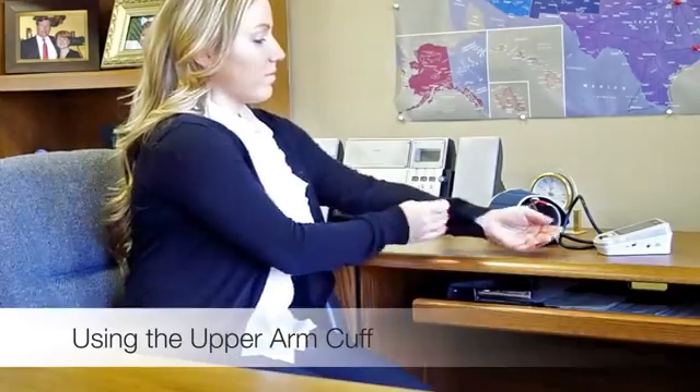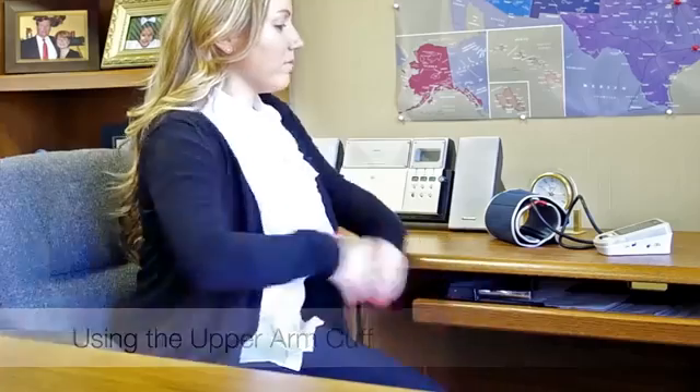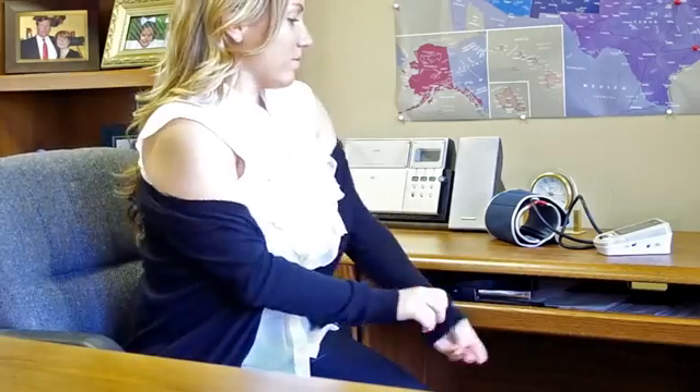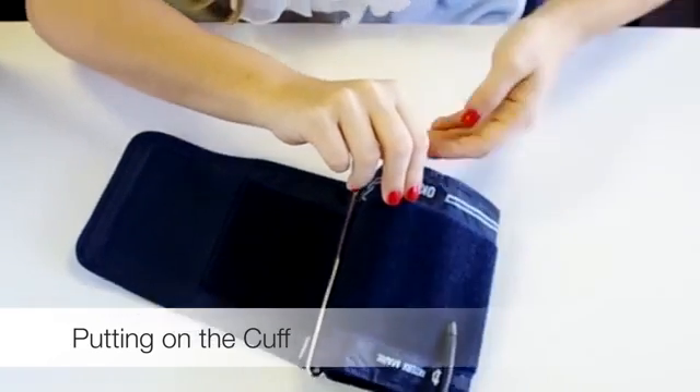Avoid placing the cuff over clothing. If you have loose sleeves, you may roll them up. If they do not roll to the shoulder or constrict the arm, remove the garment as it may impede measurement. Extend your arm out, palm up, and keep it relaxed.